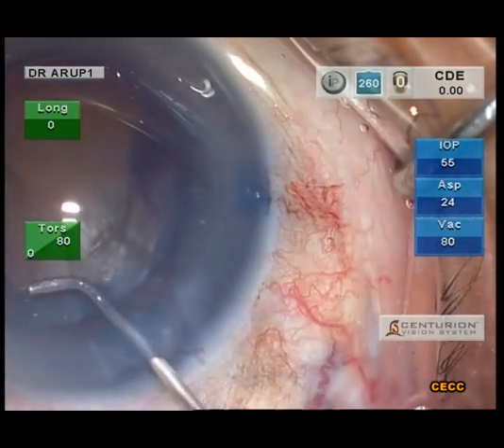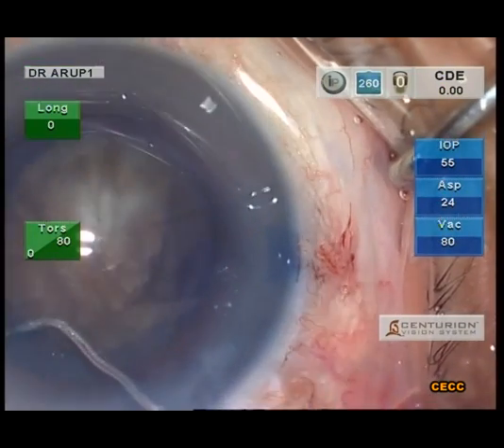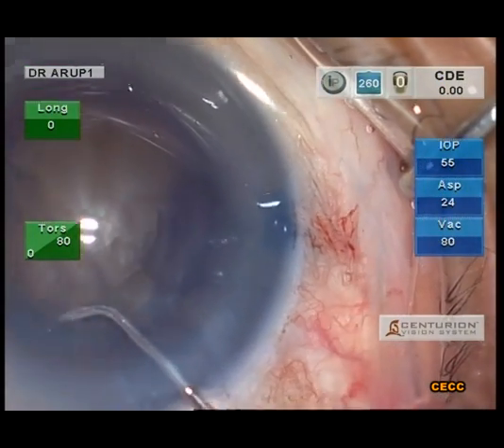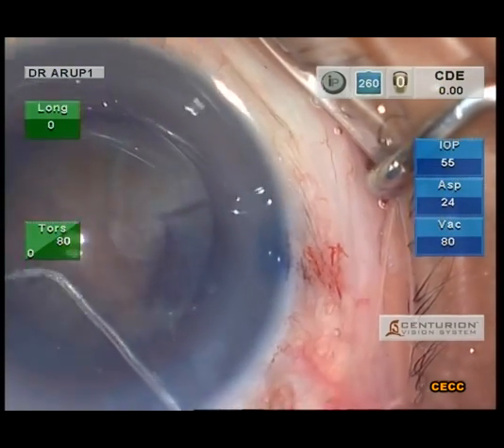Cortical cleaving hydrodissection is performed very gently at multiple points for fear of posterior capsular blowout. The nucleus should be pressed down each time the chamber shallows.